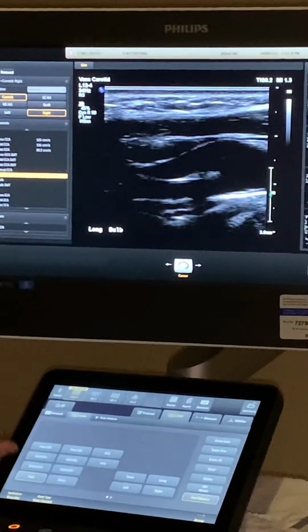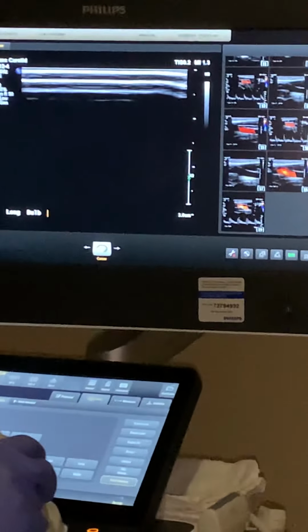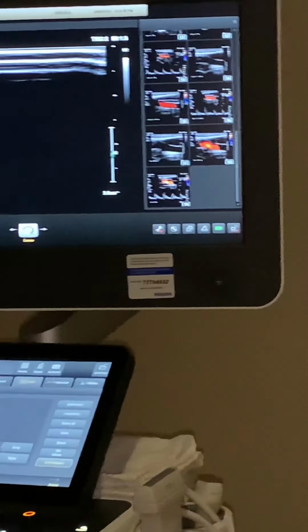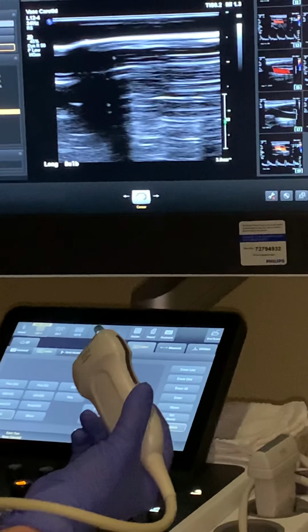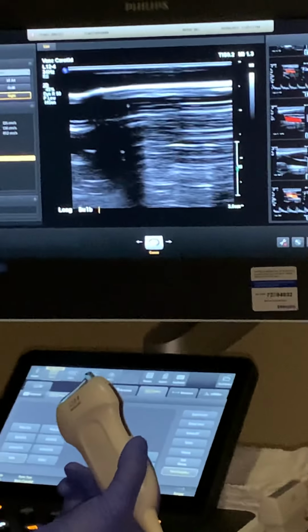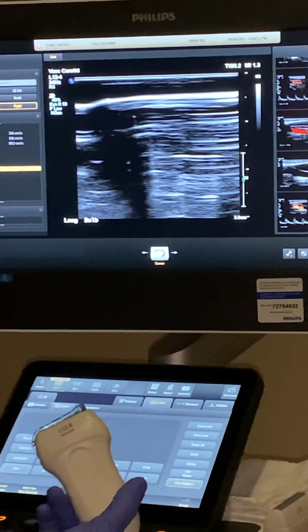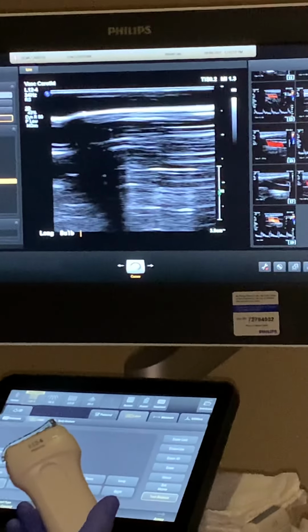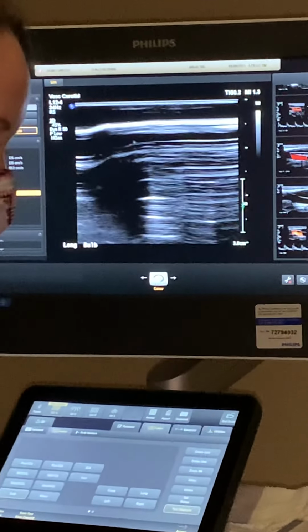And on a normal anatomy, that's kind of how I remembered it: your face is external, or on the outside of your body, so most of the time you're angling in towards your face, which is what it feeds. Your brain is internal, and so your ICA is going to feed your brain, and it's more lateral on a normal anatomy person.